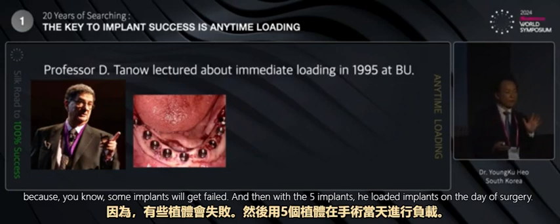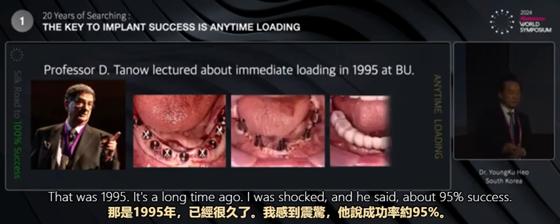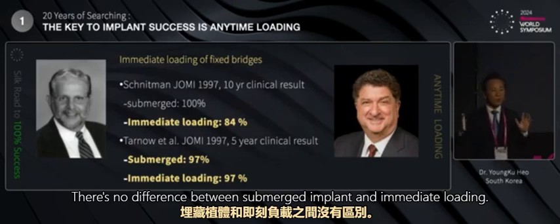With the other 5 implants, he loaded at the day of surgery. That was 1995, a long time ago. I was shocked. He reported about 95% success, with no difference between submerged implants and immediate loading.